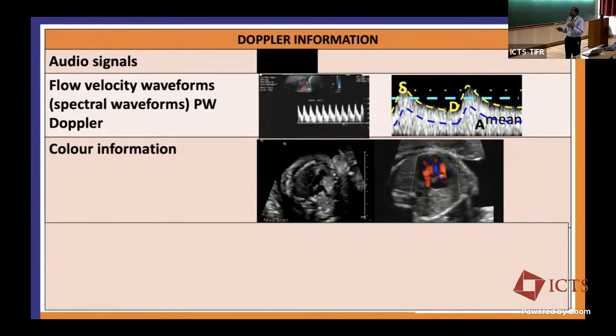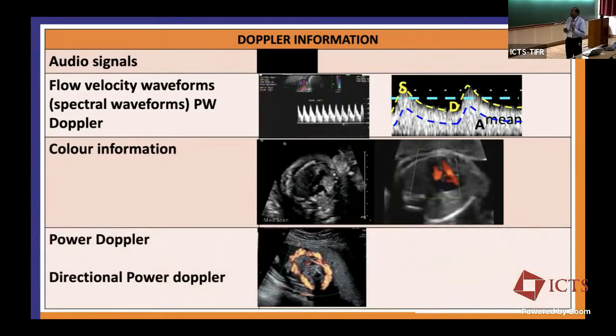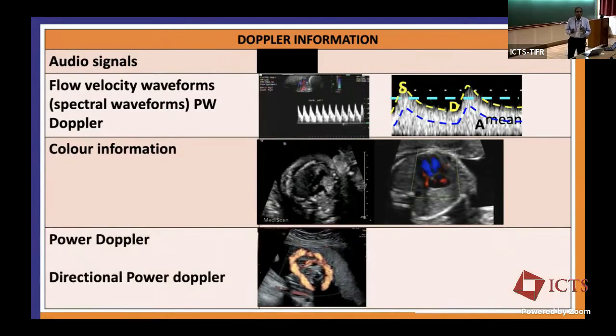I'm also able to get whether the flow is smooth or turbulent. You can see here, this bright spot here tells me that's very high velocity flow there. So instantly I'm able to recognize these are the spots I need to sample, put on your sample volume and get the information there.